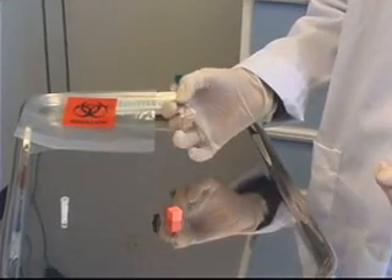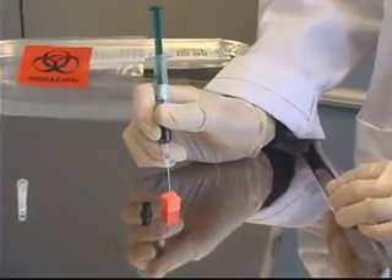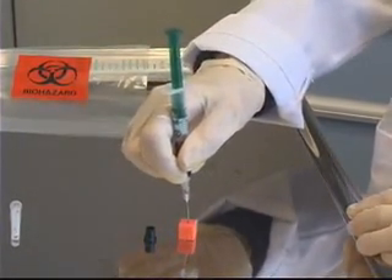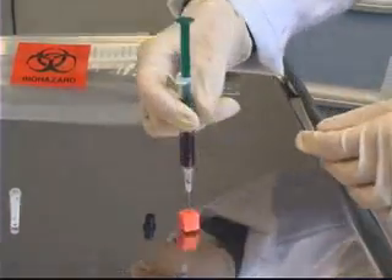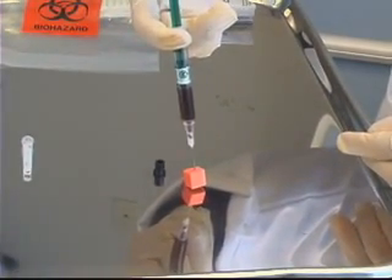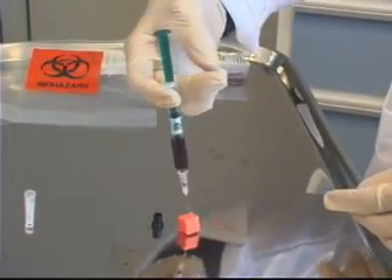While my patient is holding pressure over the site, I'm going to take my needle and syringe over to the air cube and insert the needle straight up and down into the cube. I want to put it in far enough that the bevel is covered, but not so far that it goes all the way through. I'm then going to push down on the plunger, which will expel any extra air that might have gotten into the syringe so it won't affect the results.